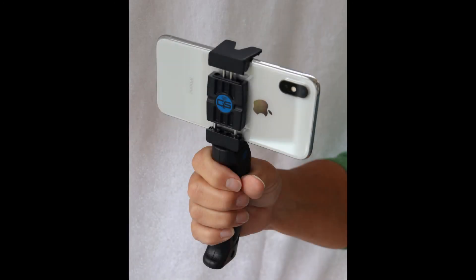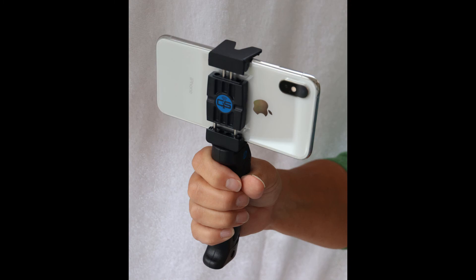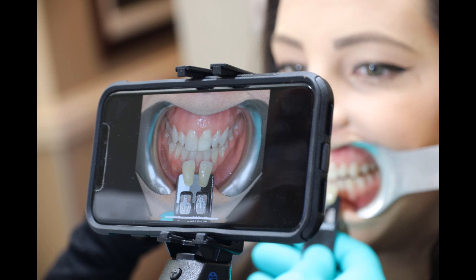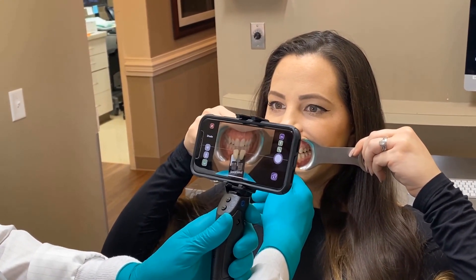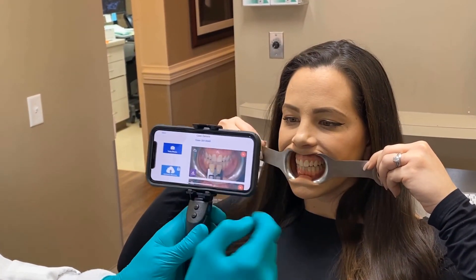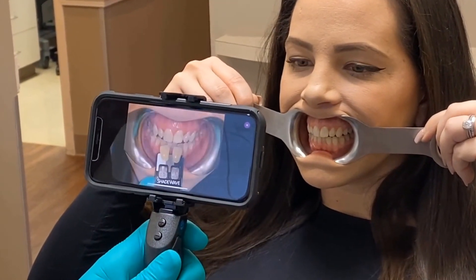Let's take a practice photo. Hold the camera horizontally, get about four to five inches away from an object, and say the word 'snap' nice and clear — this should take the photo. Then go to the photo gallery, upload, and you're done.